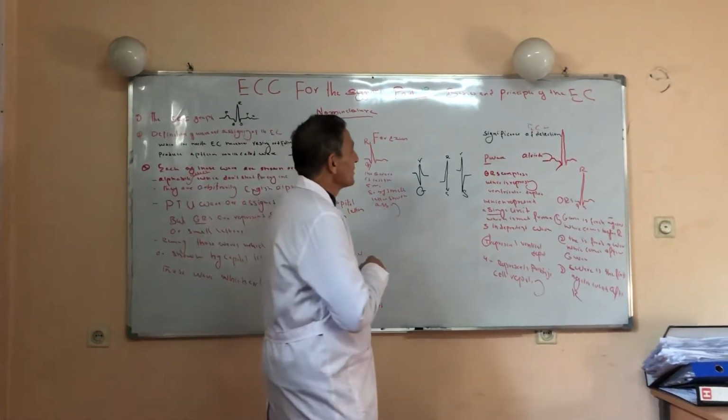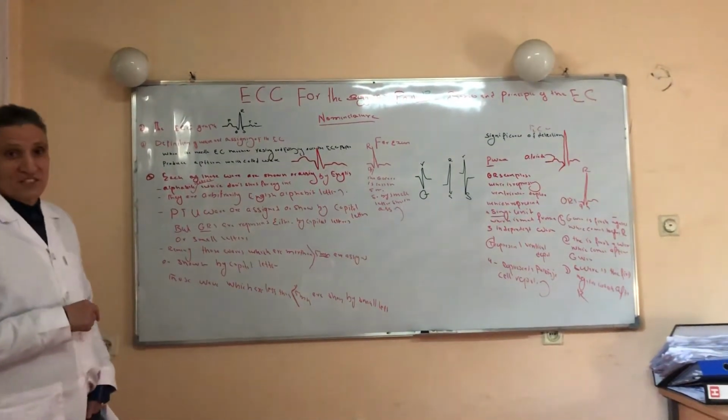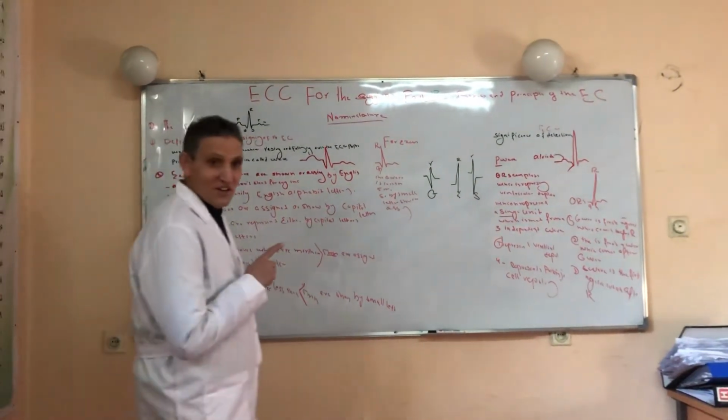13, Basic and Principle of the ECG. In today's lecture, we'll be discussing the nomenclature of the ECG.